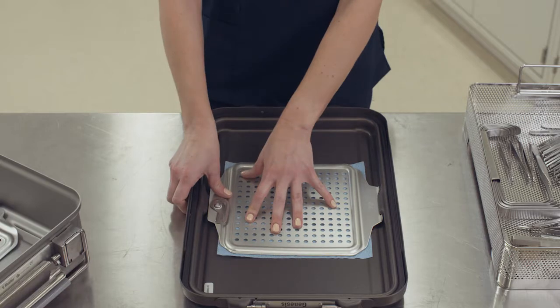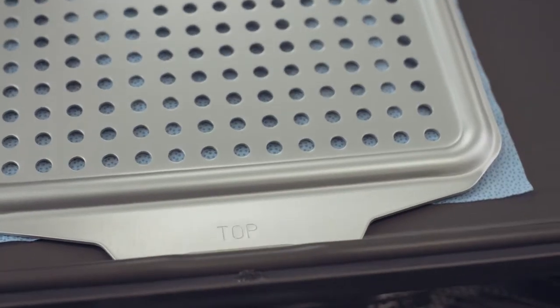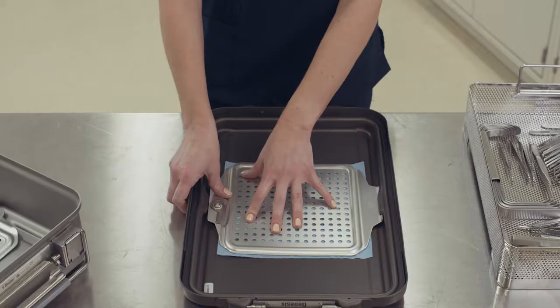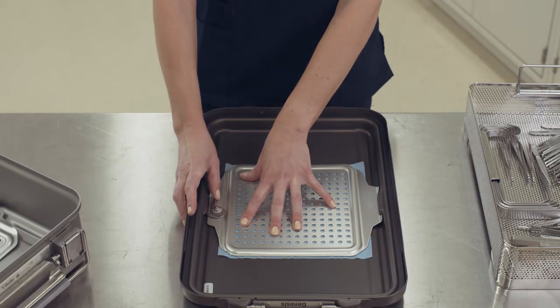Note that the filter retention plates are stamped bottom or top as a guide for appropriate placement. To secure the filter retention plate, apply downward pressure to the plate. Simultaneously rotate the lever toward the side of the container. Make sure the lever is rotated completely and the retention plate is locked firmly in place.